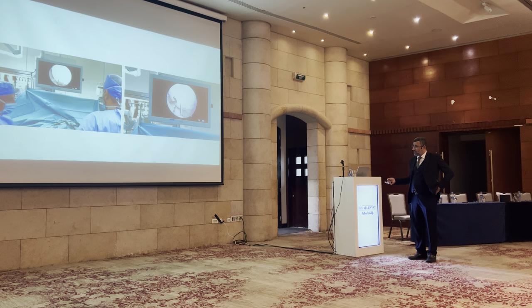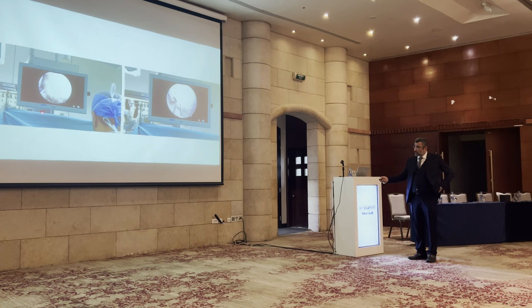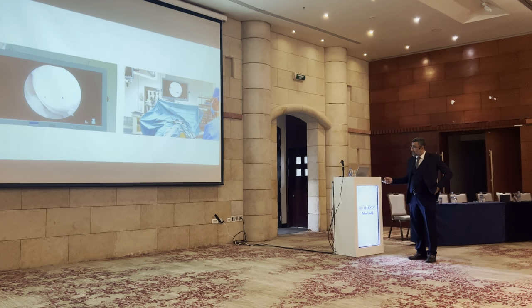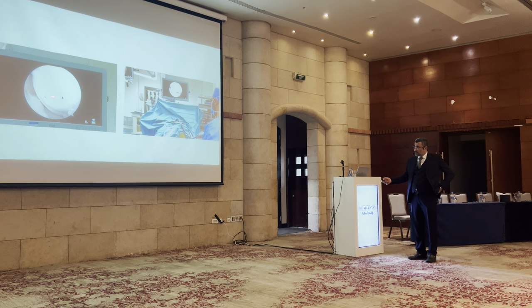Now, fixation here of the first wire. Then, define where to put the second wire, again here, progression of the wire, first screw, second screw. And now this is after fixation.